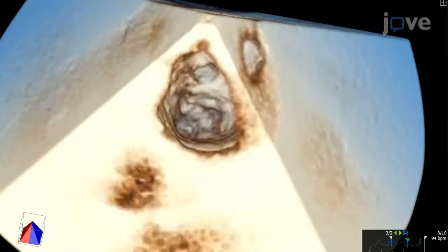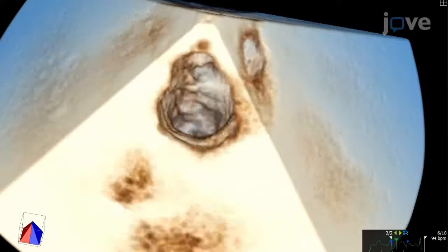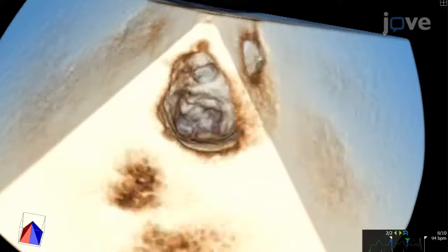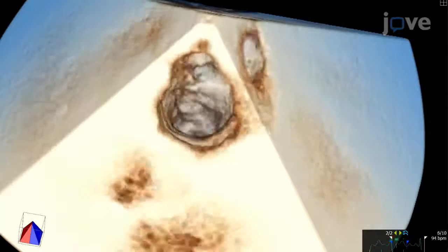Conventional 2D echocardiography is not suitable for displaying and measuring most of the specific pulmonary vein type parameters that affect the pulmonary vein isolation's outcome. However, the 3D method can overcome the 2D limitations. 3D TEE could replace the CT in the visualization of pulmonary veins with the advantages that it requires less time, the cost is lower, and it doesn't expose the patient to radiation.